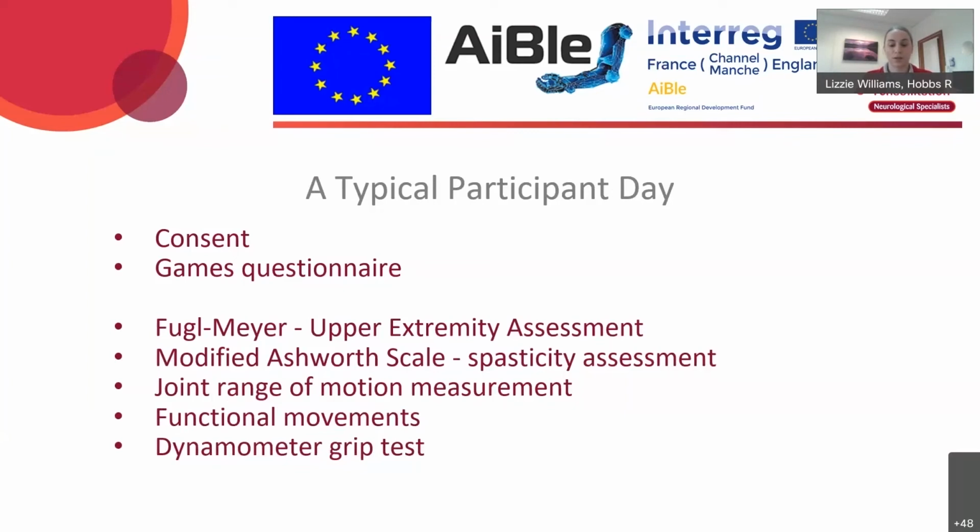To be able to document and store the data from the following assessments, we used a live document for each participant that was saved straight into their participant folder on our secure cloud. With each participant, our therapist completed a Fugl-Meyer upper extremity assessment, modified Ashworth scales of the elbow and wrist flexors, and joint range of motion recording for the affected upper limb.